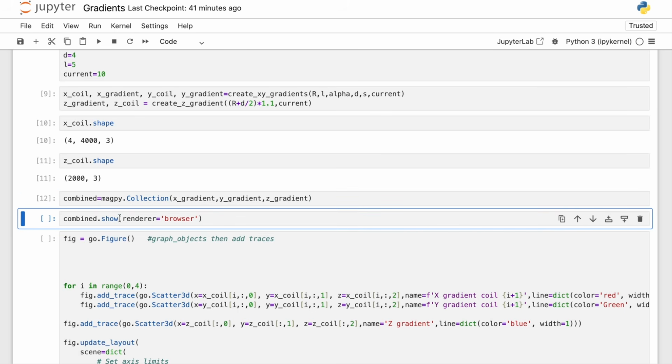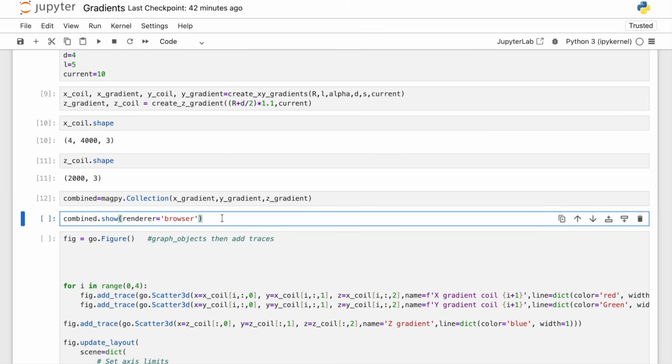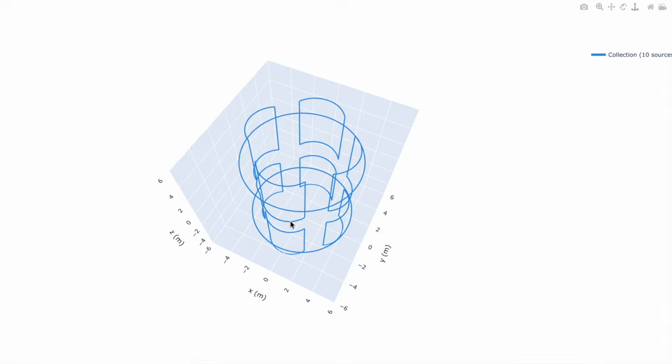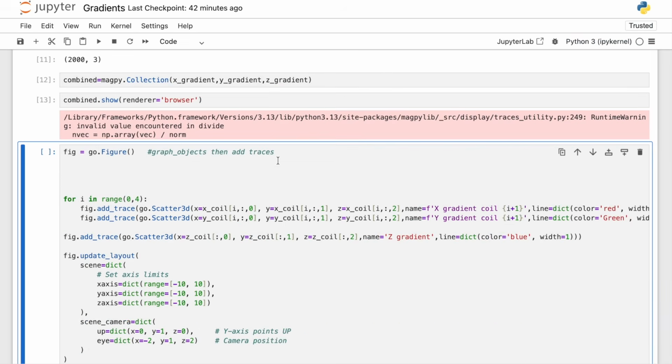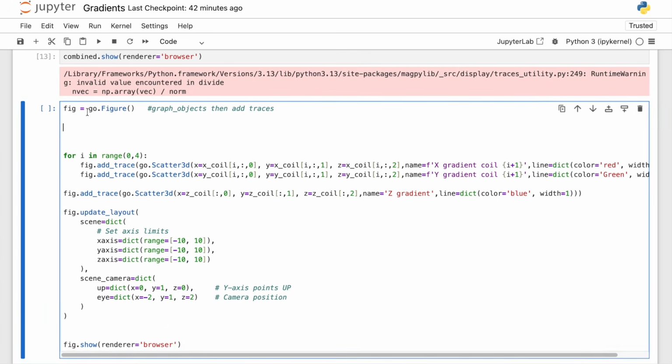We can use the Magpylib's native show function and render it in the browser and see the direction of currents and general visualization. So here we see everything matches our expectations. There are no visual errors. But for better visualization, we will use the Plotly library. So we will create a figure, and in the figure we will add 4 traces for each x coil and y coil. Why 4? Because x and y gradients were composed of 4 saddles. So here I will just iterate over each saddle. And for z, it's just 1 gradient coil, which is again composed of 2 coils, but it's saved as 1.